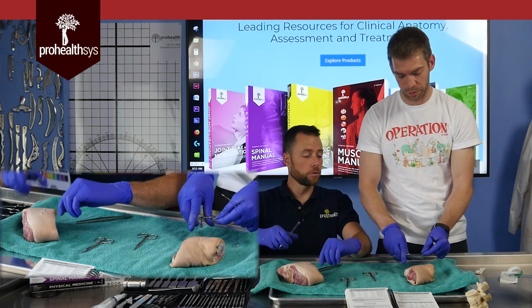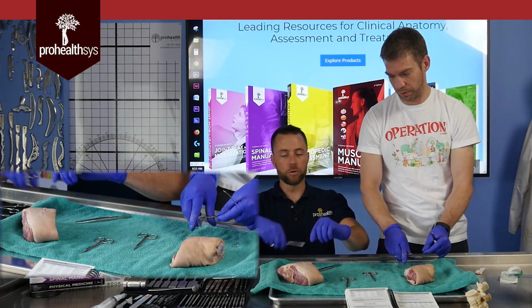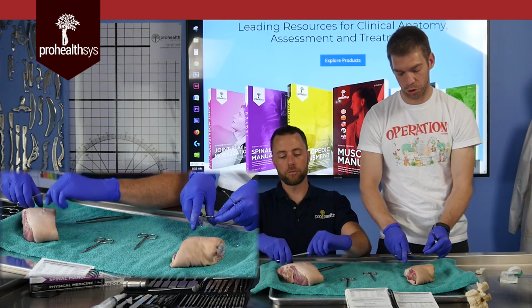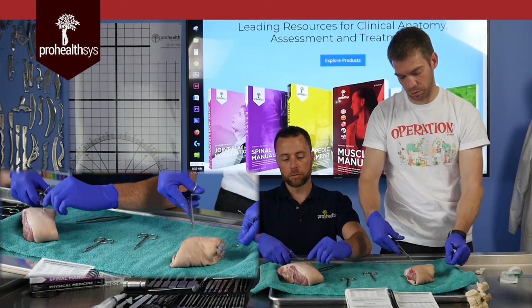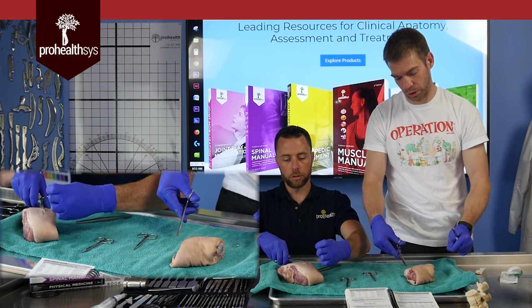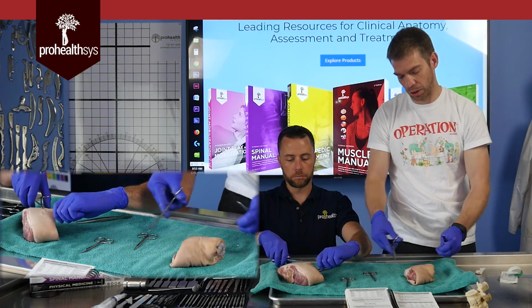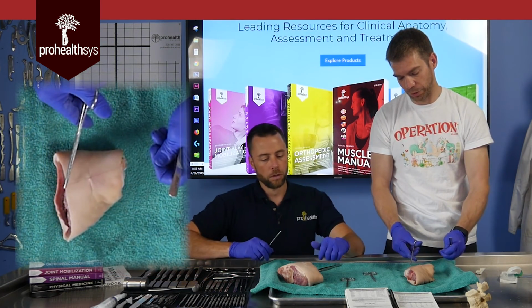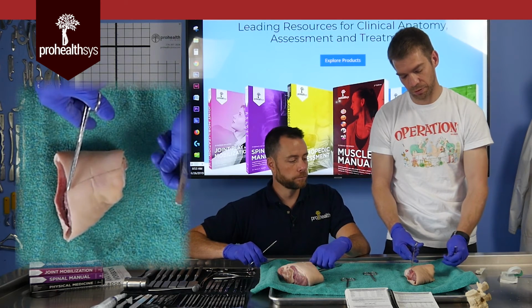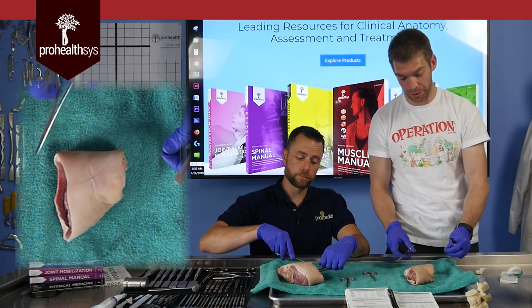You have 2 options here too. Some people like to keep it spaced and then keep working around. I prefer to do a double where I'm using both hands at the same time. So I'll just wrap, even a triple wrap if you want, and you can cycle through this relatively quickly once you get into it. After the second knot, you can still tighten a little bit, oops, I pulled a little bit of suture up there. But after the second one, that's it. You can't tighten up anymore. That's what you've got. So if it's too loose, then you have to do it again.